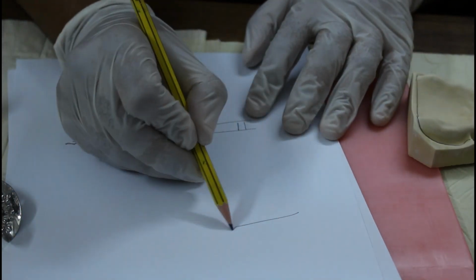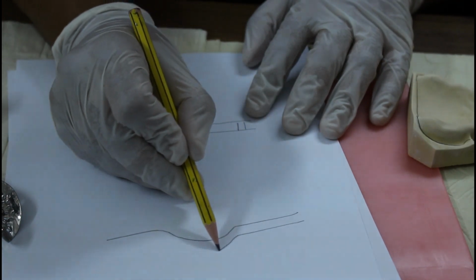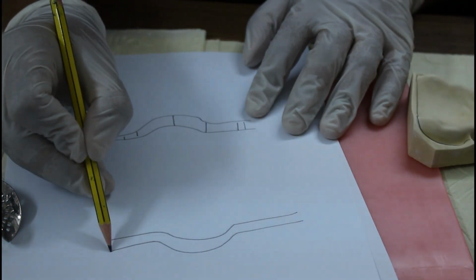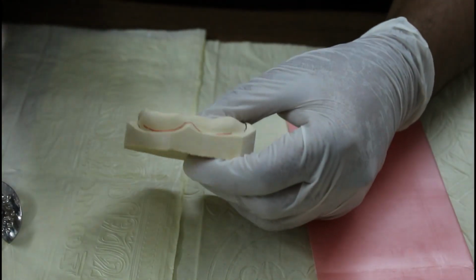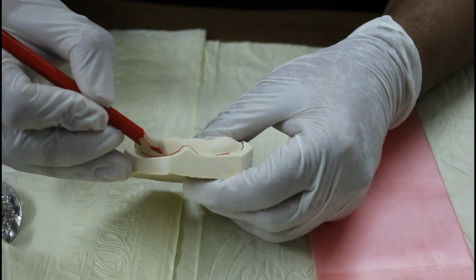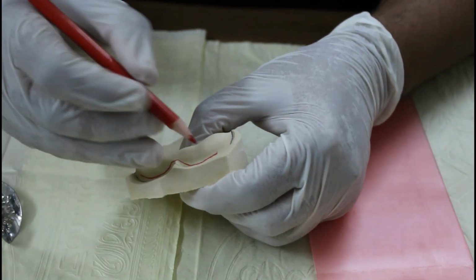So it is going like this, frenum coming. Your next line should be 2 millimeters above. It should go up with the frenum, go down in the sulcus. Do not make it flat like this. As you can see in the cast now, this second line is 2 millimeters above and it is going up along with the frenum.